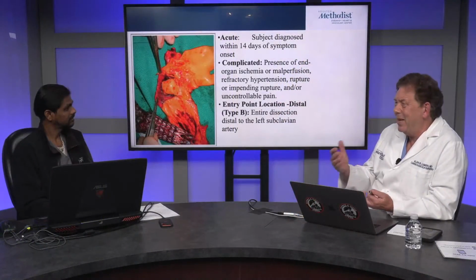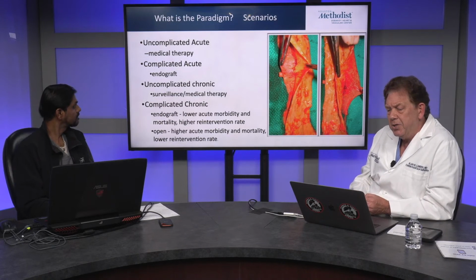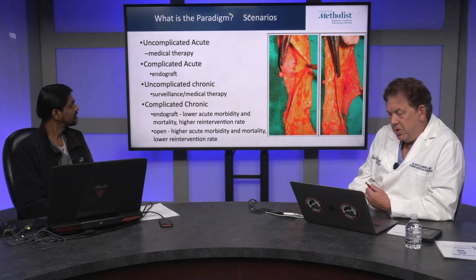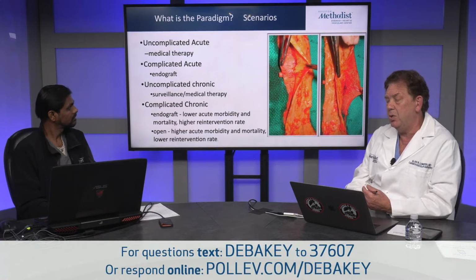Where the stent graft had been placed, it did reappose the true lumen onto the false lumen, so it works the way you would think. But downstream, of course, the dissection persists, and what you're looking at here is pathology in action. This is a tube of atheroma, because this aorta has almost been completely avulsed circumferentially, or at least the intima has, and this is a tube of atheroma bridging into the left renal.